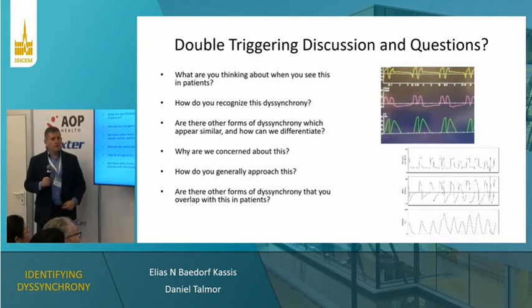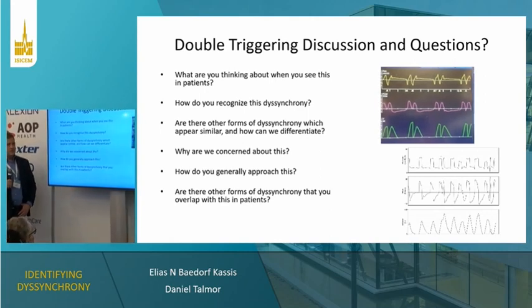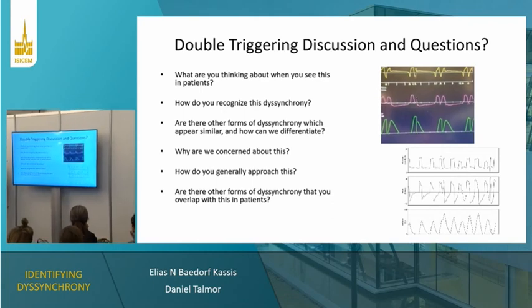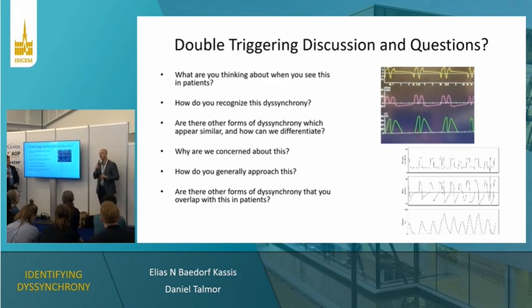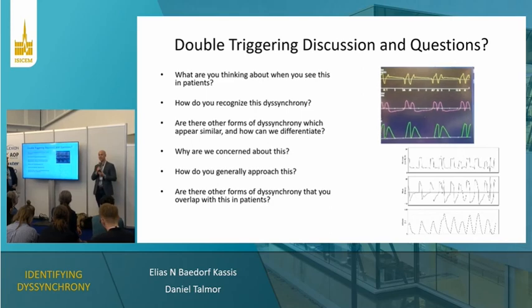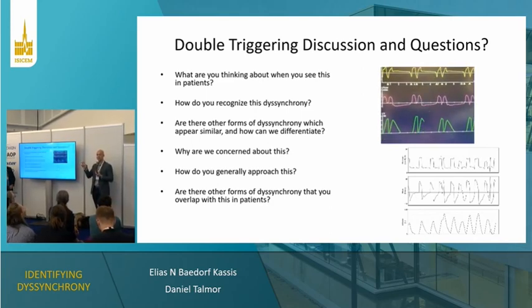Okay, so sedation is one of the key factors, absolutely, and we'll get into that in a moment as well. Anything that we can do on the ventilator itself? What's that? Yeah, so this is a discordance oftentimes between what the patient's desired inspiratory time is and what's set on the ventilator. And in some cases, you can adjust the inspiratory time to actually match what the patient wants.